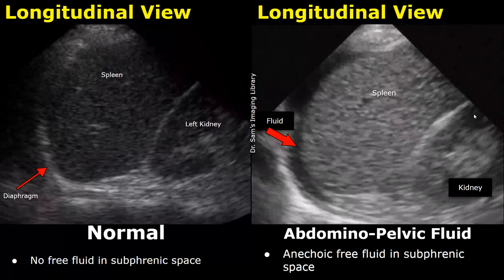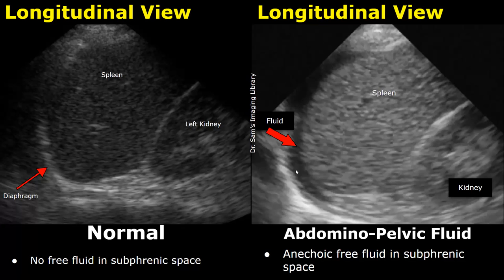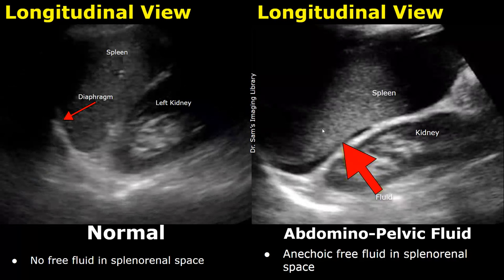Now we go over to the left upper quadrant to scan the left pleural space, subphrenic space, and the splenorenal space. In the normal image, no fluid is seen below the diaphragm, within the pleural space, or between the spleen and left kidney. In this image we see free fluid in the subphrenic space — anechoic fluid is seen between the diaphragm and the spleen. In this image we can also see anechoic fluid between the spleen and left kidney.